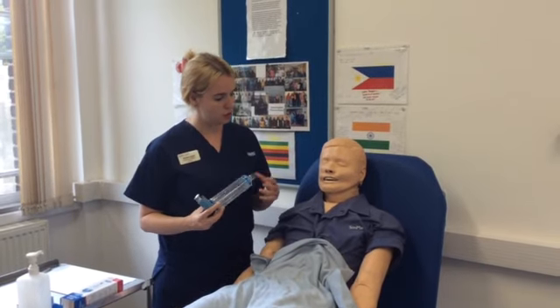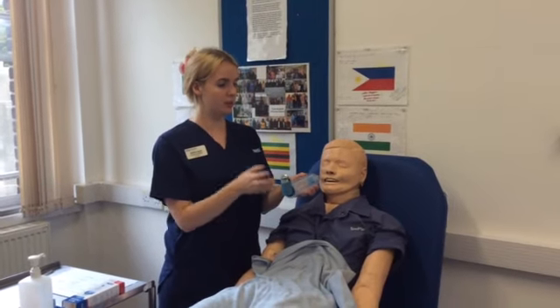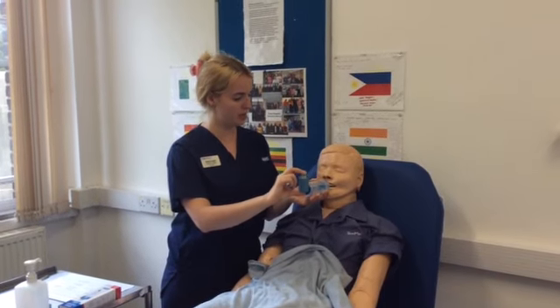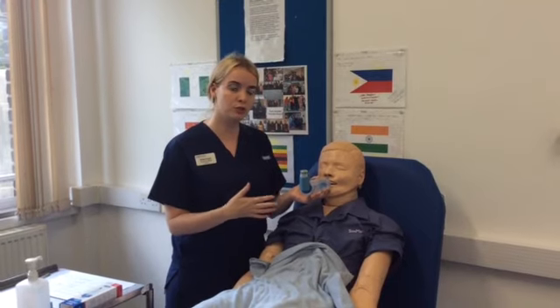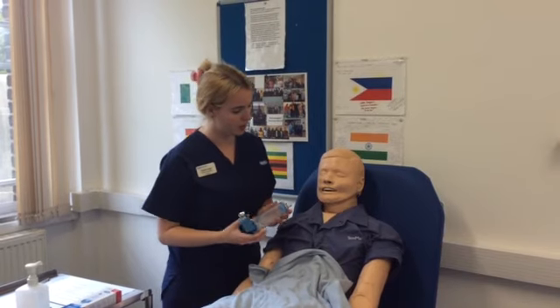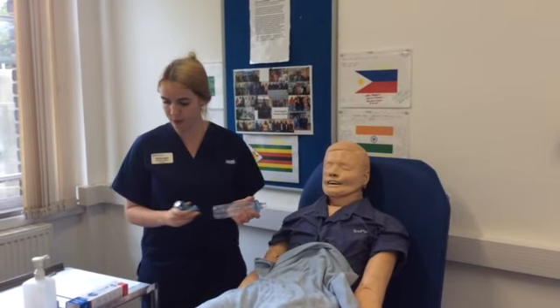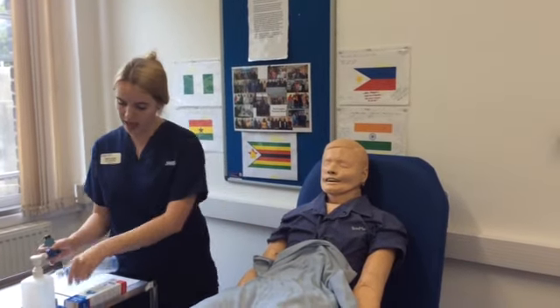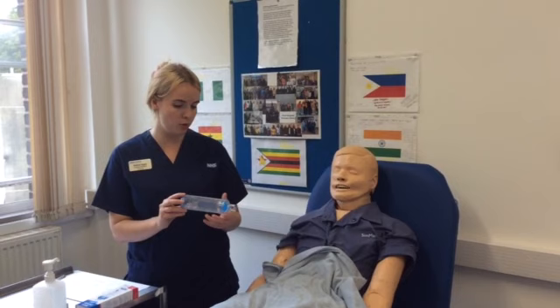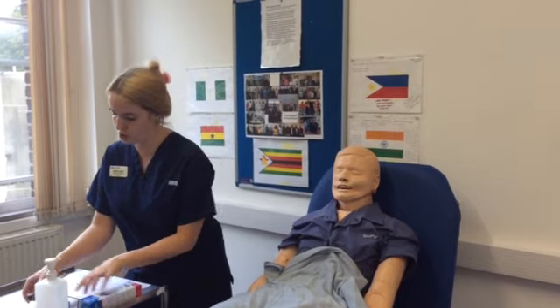Okay, so assuming it's been 30 seconds, so exactly the same again, James. So breathe in, breathe out, this in your mouth, make a seal, depress the canister, breathe normally for 2 to 5 seconds, remove this and breathe out. Okay. Thank you. So I'm all done with this now. I'm just going to complete my paperwork. This space chamber and the inhaler is yours to keep because it's single patient use. With the space chamber, what you can do is wash this with soap and water. I'm going to put it back in the box for you.